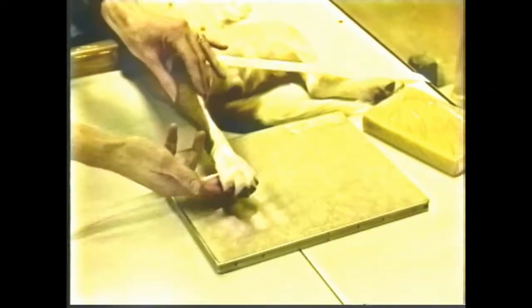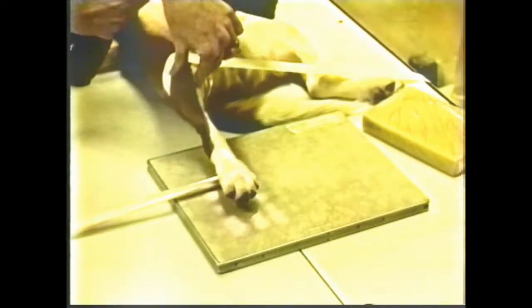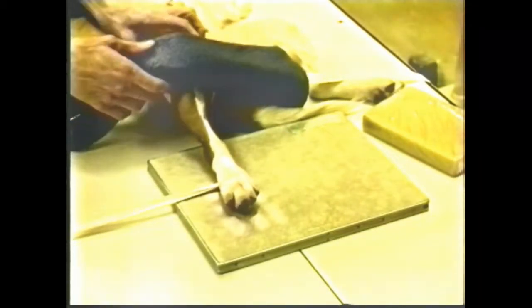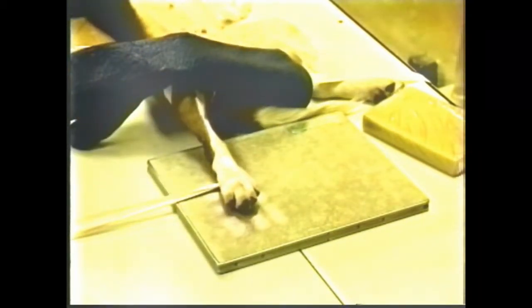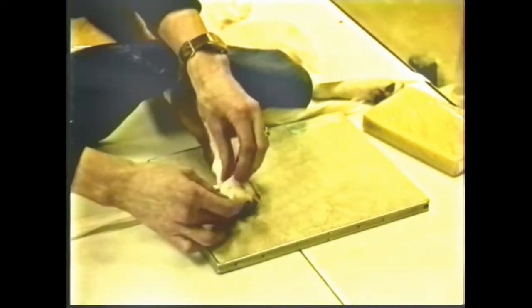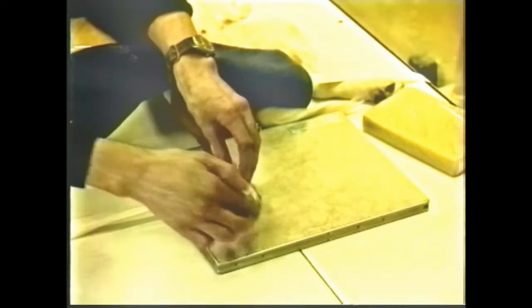Since obliques are often more valuable than laterals in examination of the toes, this demonstration will show the dorsal plantar view and 2 obliques. We will use a 3-film split tabletop in this demonstration.